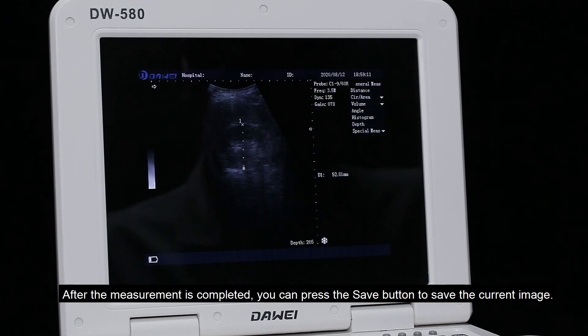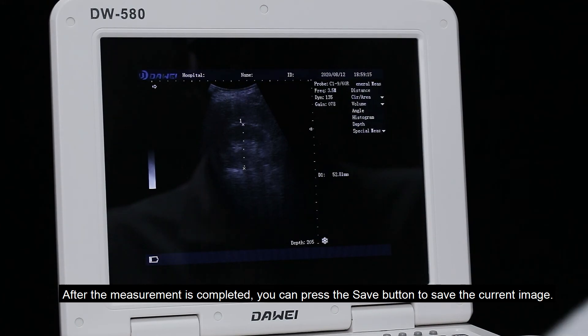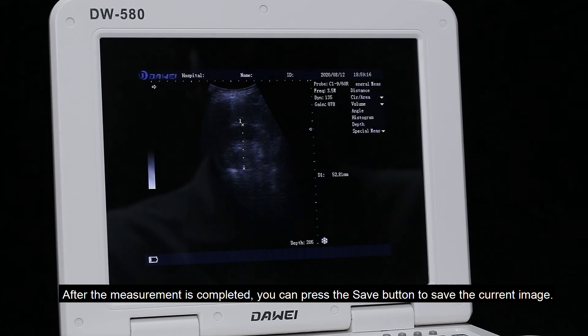After the measurement is completed, press the save button to save the current image.